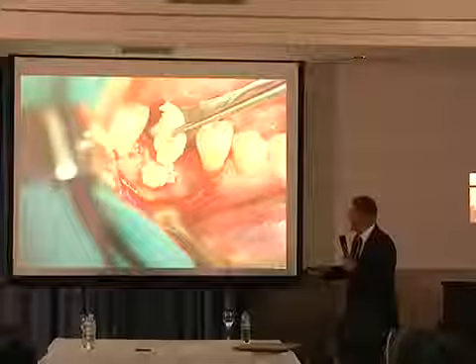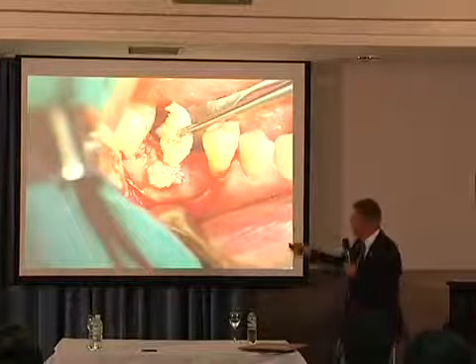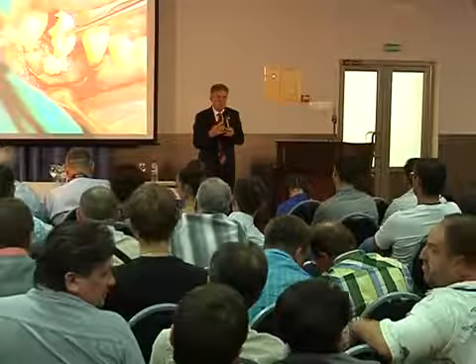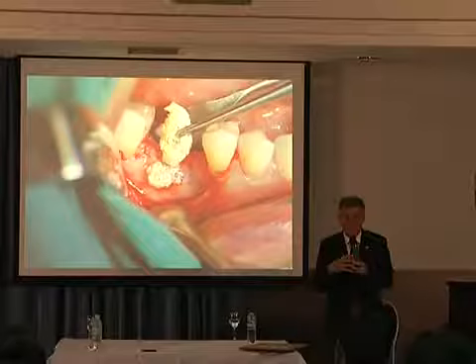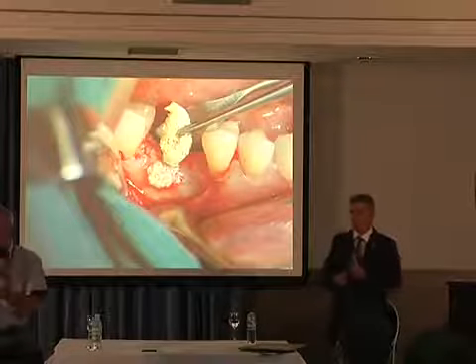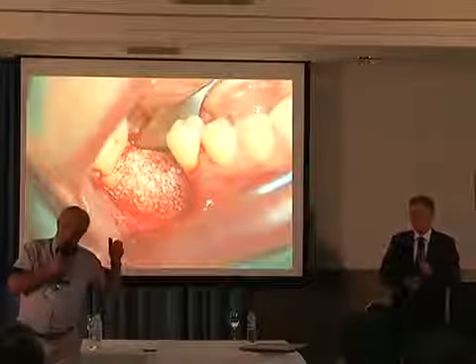Go forward. Okay. What is the basic requirement that this biomaterial can organize into new bone? What is necessary for a biomaterial to get new bone? What do you think is the most important requirement for this bone substitute material, in this case BioOS, to turn into your own bone?